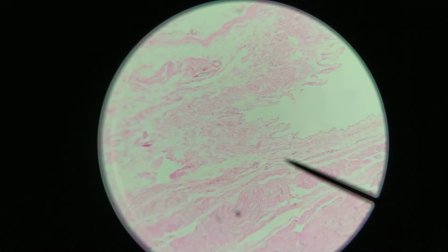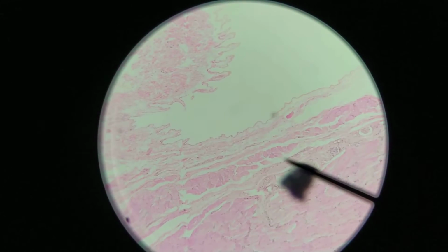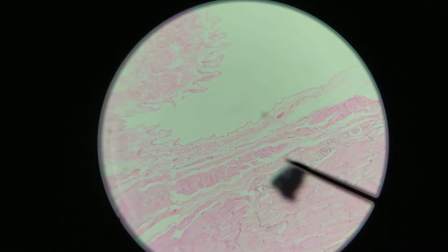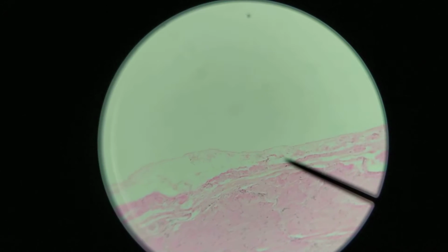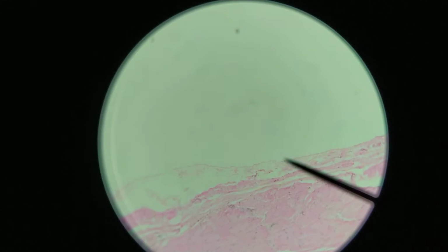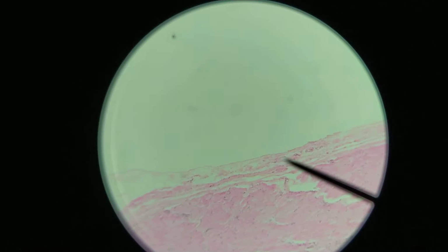Now the interesting thing is that as we go along, the tunica adventitia ends, and that's a bit of dirt. I should have wiped this slide. But as we go along, you can start to see that the tunica adventitia becomes replaced by a smooth surface on the outside. So what we're seeing here is a transition to a tunica serosa. A tunica serosa is a loose connective tissue outer layer with a simple squamous mesothelium around the outside. So that's what you're seeing out here, the tunica serosa.